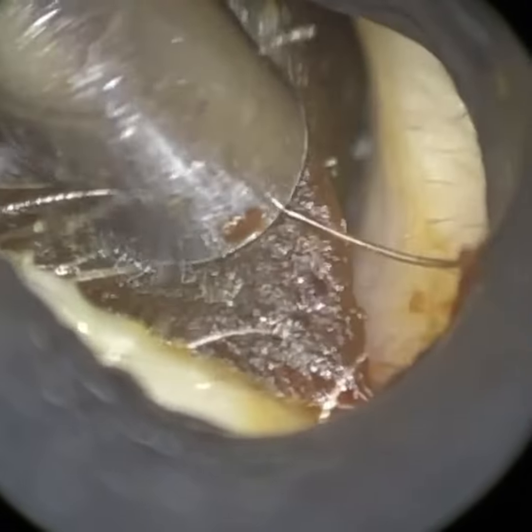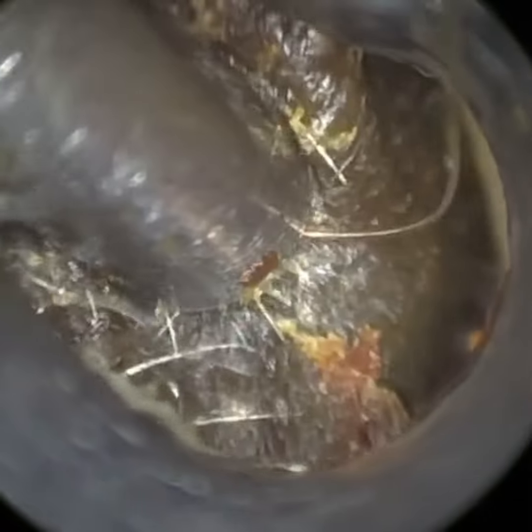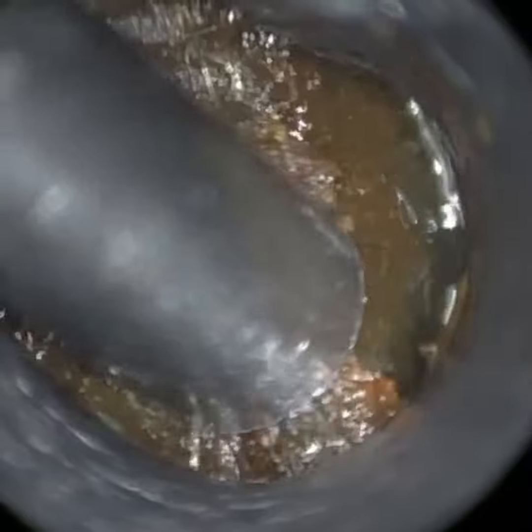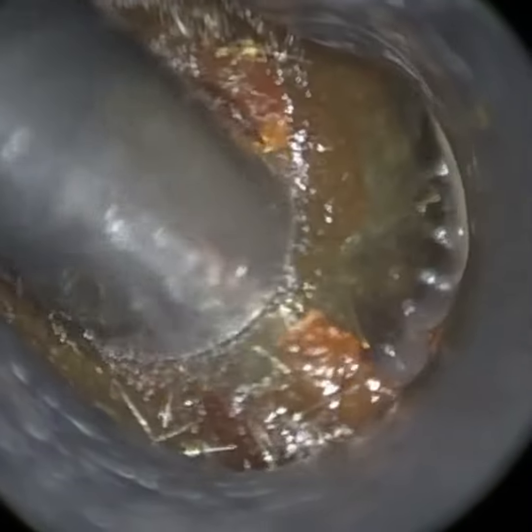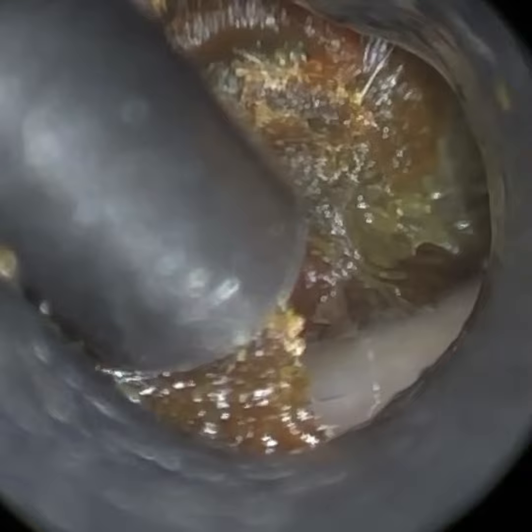Now we're on to the patient's right ear. Again, the entrance is narrow, but I'm just straightening it using the speculum. This is where I think the Waxscope will benefit a lot more people than the endoscope. The eye-clear scope we've developed has been designed specifically for wax removal to provide optimal optics. But people do struggle with dilating the ear canal because there's no speculum with an endoscope — you're having to use the tip of the endoscope to manipulate and stretch the ear open. This is where the Waxscope comes into its own.